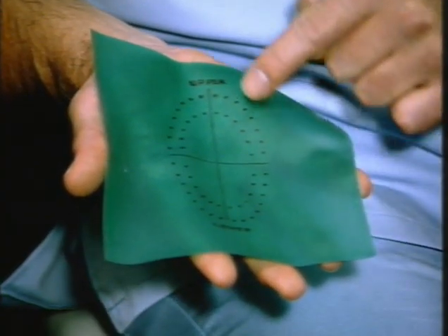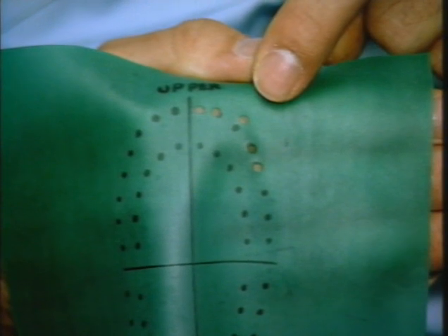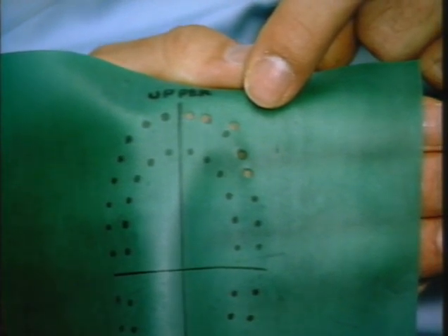Obviously, it's very much more simple and convenient to use a stamp of average tooth position, and you'll see this mapped out on this bit of dam that I've got here. However, sometimes you may have a tooth which is awkwardly placed. It may be outside the arch, or you've got a very deep cervical cavity. So that you don't actually stretch the dam awkwardly into that position, in these circumstances it's best to place the hole actually outside the arch. In this way, this enables you to cover the displacement or the extreme area of retraction.